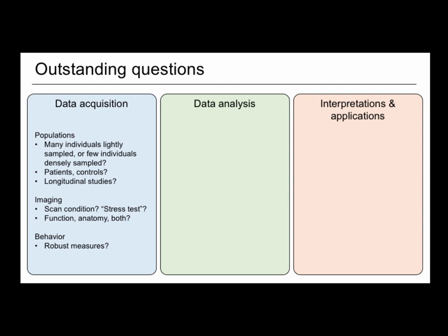I think the cognitive tasks and even the more naturalistic behavioral captures, like free speech or playing a game or social cooperation, some of these measures could be really, really interesting to try and predict from fMRI data. And I've already touched on this question of within versus between variability. Data analysis. So we have our data in hand.